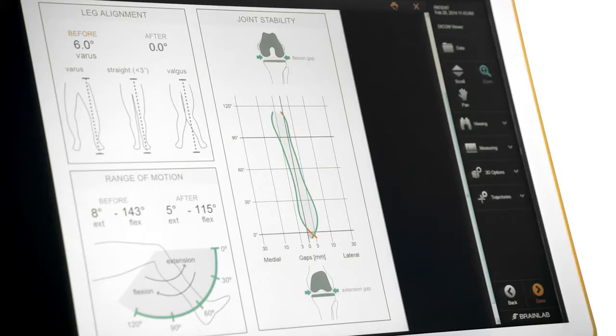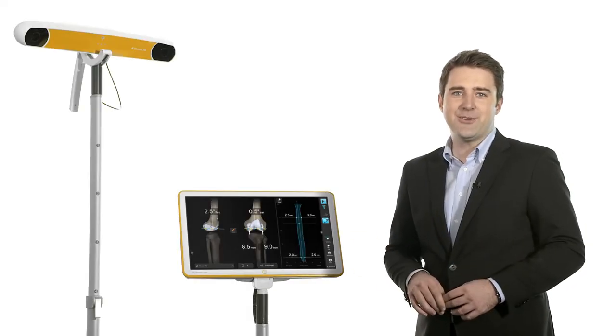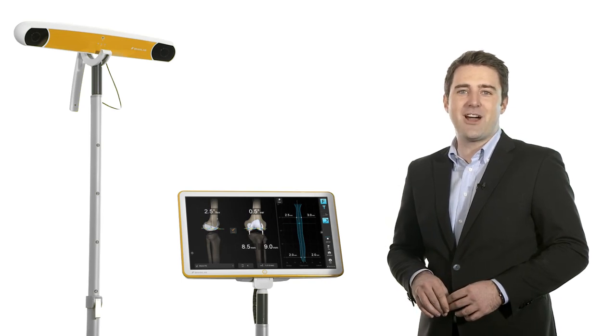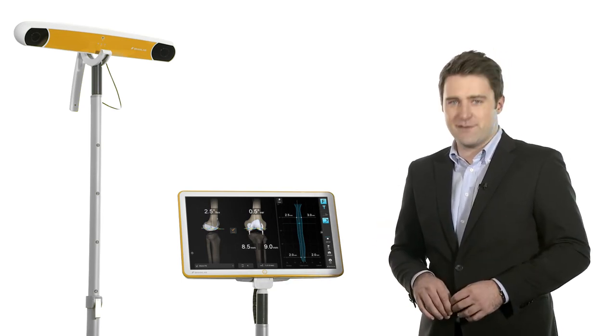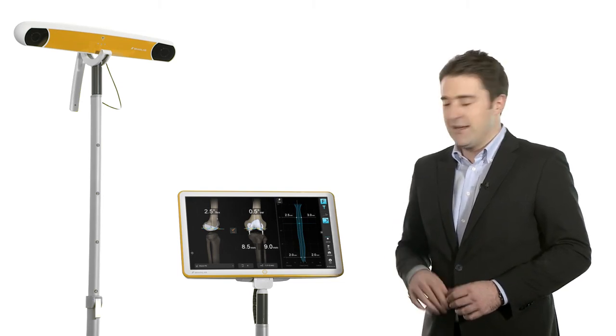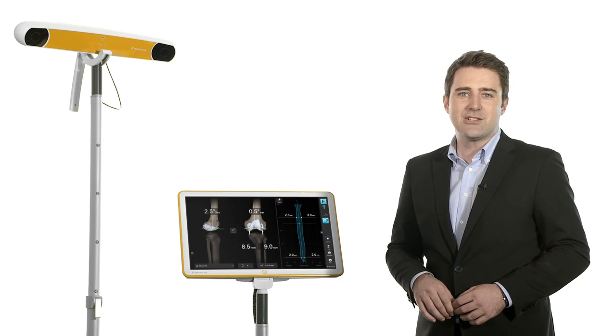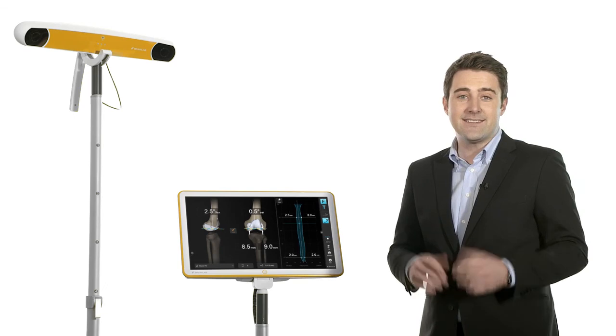After each procedure, a patient report, which is optimized for documentation and communication in daily practice, is automatically generated by the software. The intuitive software approach allows surgeons to adjust to the surgical environment, thereby potentially decreasing surgical time and providing the flexibility to manage unforeseen circumstances on the fly. Knee 3 marks a new generation of software-guided knee surgery, which places the power and control of orthopedic navigation in the hands of the surgeon.